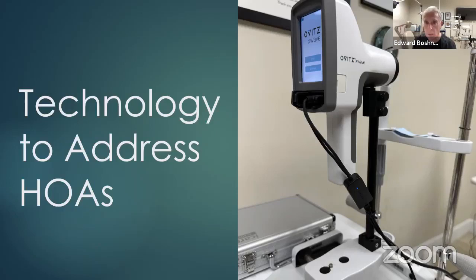Again, Ovitz.us. So we take images of a lens. We send the images with the HOA readings to a laboratory associated with University of Rochester, New York. They take that information and send it to the lab. The lab in this case is iPrint, and they embed that into the optics of a scleral lens. So we call that kind of lens a wavefront design scleral lens.